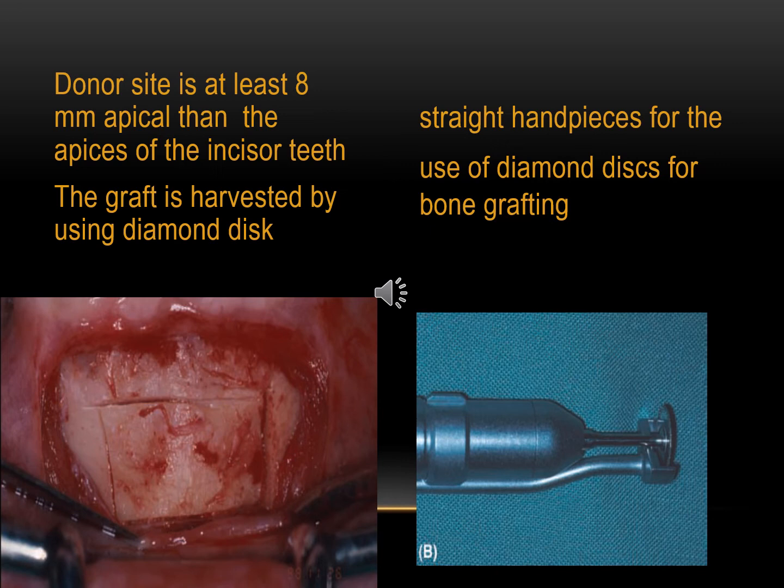The cutting is limited inside the cortical bone of the buccal part of the chin. We can use for this cutting a disc, micro saws, diamond burrs, or a piezo instrument, which is an ultrasonic instrument, to make the cut inside the bone.